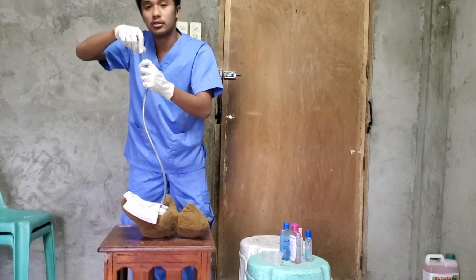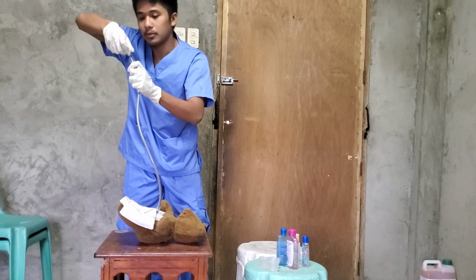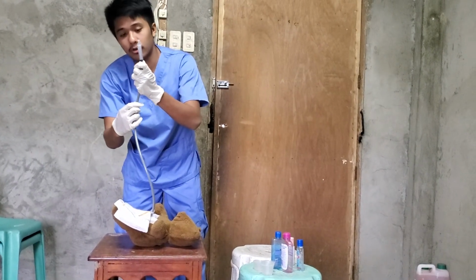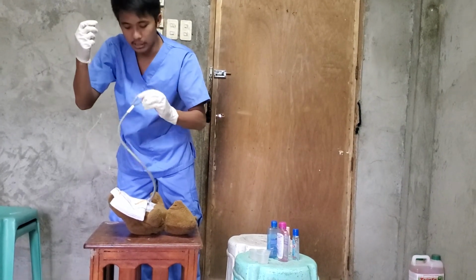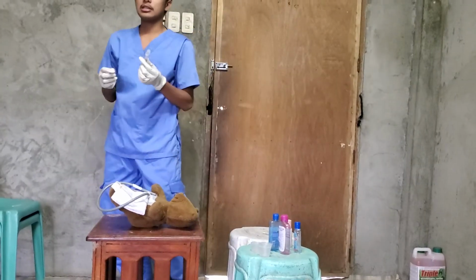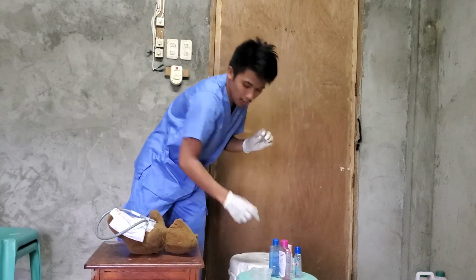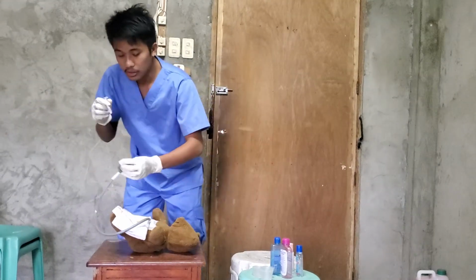Then flush the water. Before flushing, you need to open the clamp. So flush. Then after flushing, close the clamp. After closing the clamp, you need to remove the syringe. Then after removing the syringe, next step is you need to remove the plunger of the syringe. Then after that, reinsert the tip of the syringe into the feeding tube.